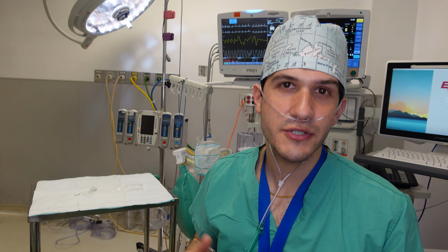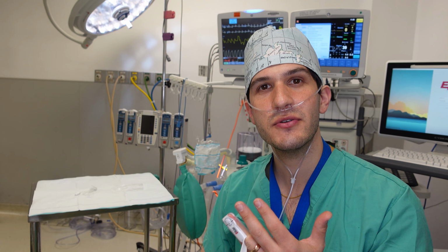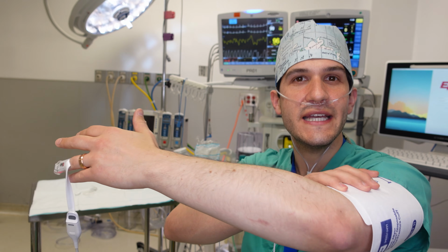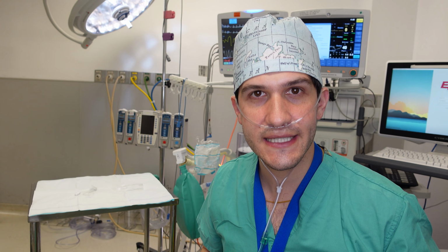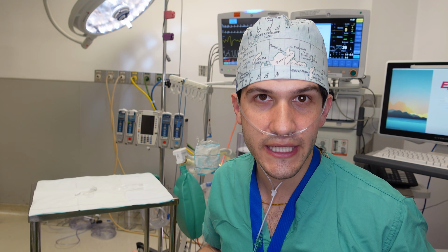When you're placing a blood pressure cuff, it's important to bear in mind that if you're putting the cuff on the same side as the pulse oximeter, as I've done in this case, then every time the cuff inflates, it's going to decrease blood flow to the pulse oximeter, which can either make it appear as if the patient is desaturating, or the pulse oximeter might just stop picking up a reading altogether.